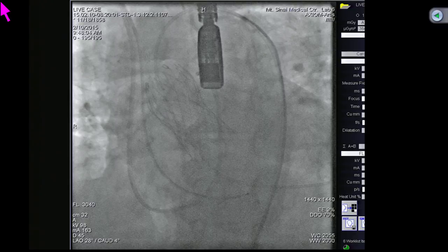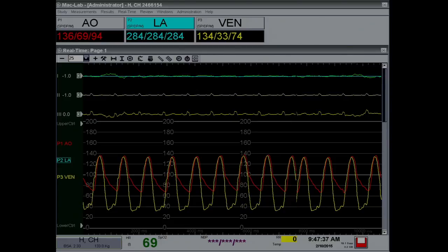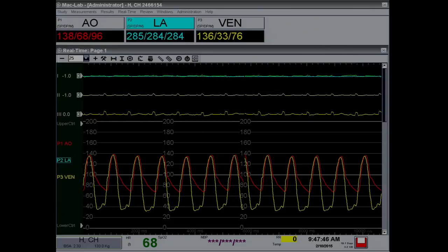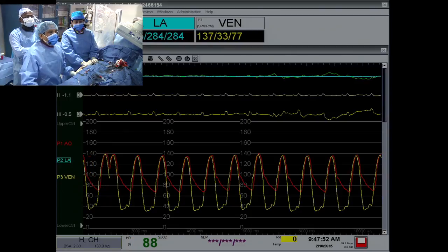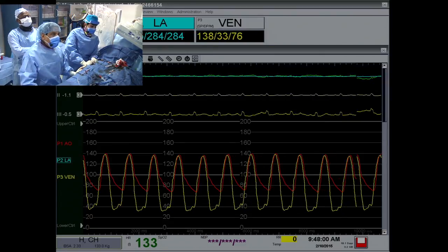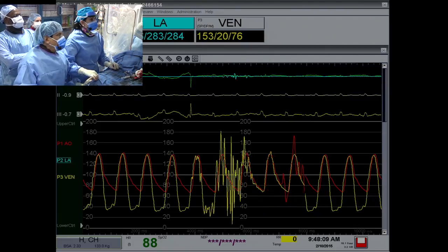It's 40 EDP. Is it? No, it was always that. We started that, so no gradient, and the diastolic blood pressure minus LVEDP divided by systolic, the regurgitant index will be more than 25. Even if there is a little bit, because if you say 70 minus 40, 30, and then divided by your systolic blood pressure about 120, 130, it will definitely come out about 25. Diastolic pressure still remains about the same. And I think we need to know a little more. Otherwise, we take the pigtail out and do a good ventricular aortogram.